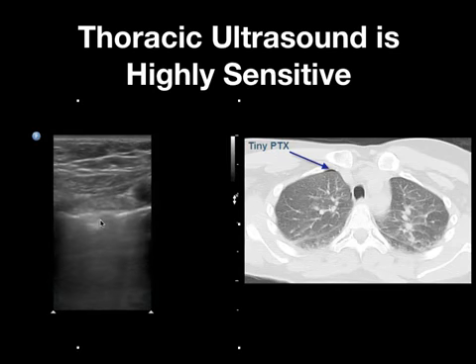So this was a patient who had a very tiny pneumothorax, and this is what we found on the CT, that this was only seen on one cut, and this is what we were looking at right here. So the bottom line is, if you can scan over the area and see the pleura, you have the ability to diagnose the tiniest of pneumothoraces. This means that this is a test that you've got to use in the context of your clinical exam. Not everybody who has evidence of a pneumothorax on ultrasound is going to need a chest tube. The same thing applies to a CT scan. Not everyone who has CT evidence of a pneumothorax is going to need a chest tube.